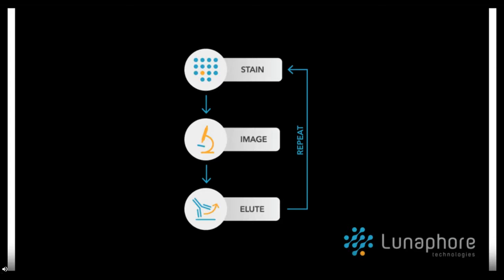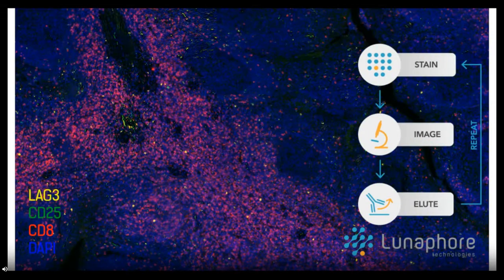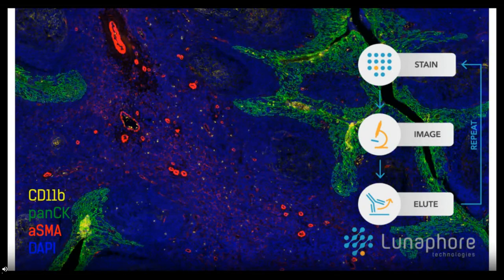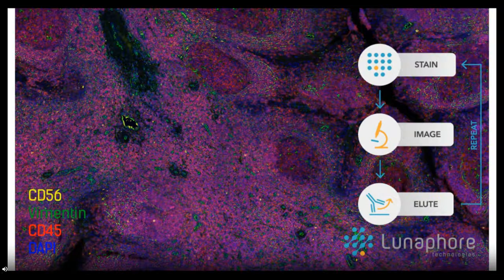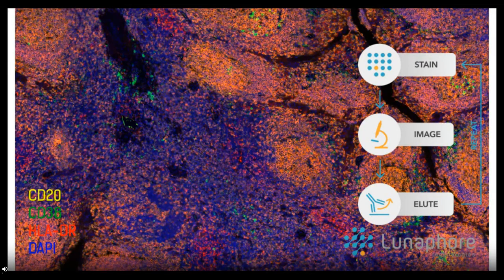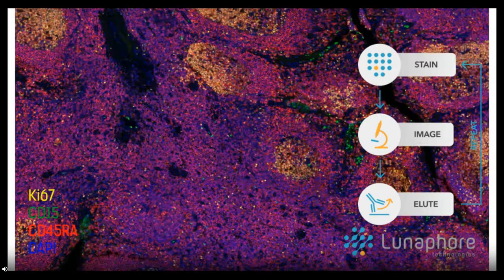that you don't need to perform this spectral deconvolution because you can use chromogens that are sufficiently far apart on the spectrum that there's no significant overlap. And then you end up with a more high-dimensional image as this. I think this is a 27-plex image, which you can't actually view, which is where image analysis becomes essential because we can't qualitatively interpret this image. So we'll go through similar workflows we've seen before.